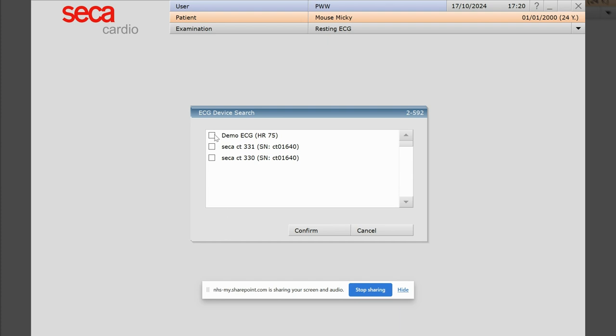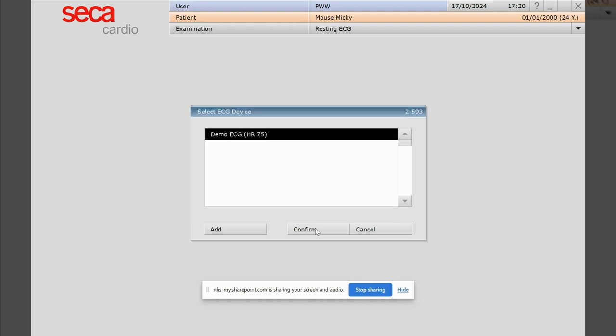Now I'm going to choose demo, but you would choose the Seeker CT331. So I'm just going to choose demo for now.